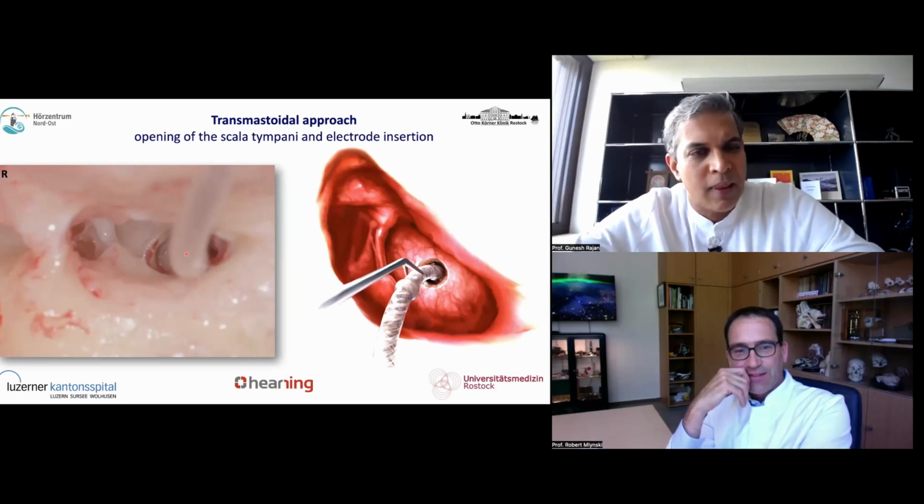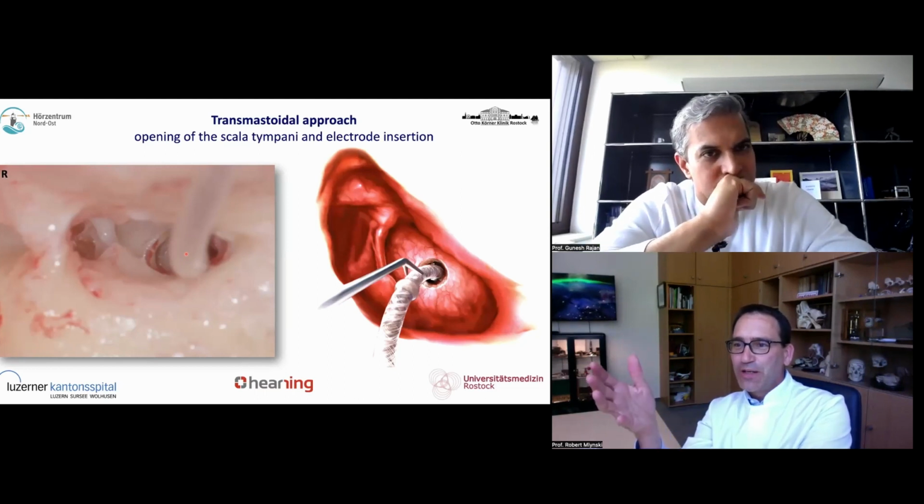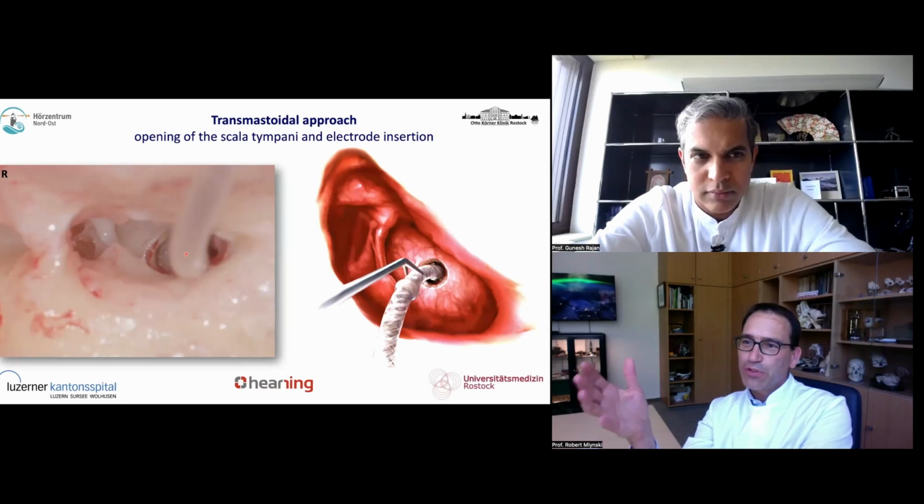Yeah, exactly. I think what you described is the Archimedes principle, where if there's one body in a space, there can't be another.